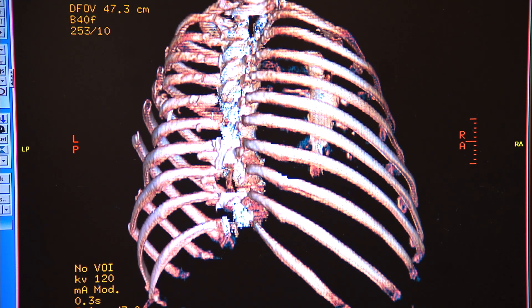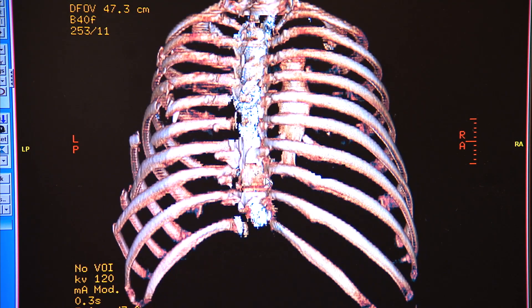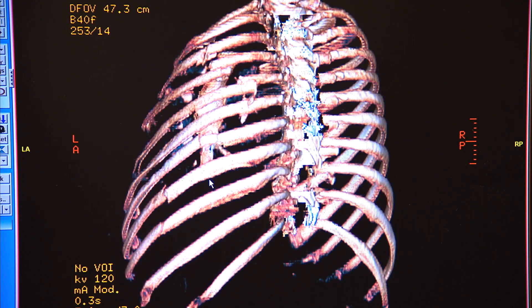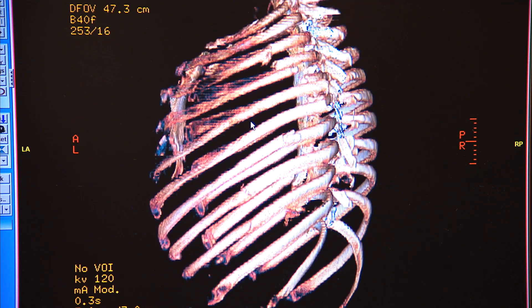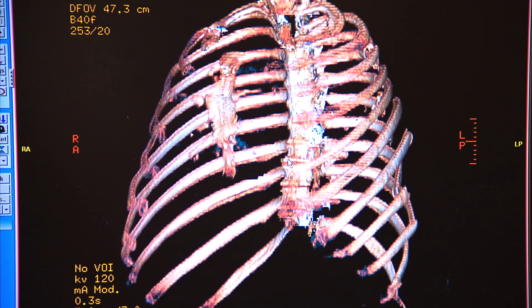We're looking at his spine along the backside, and as I rotate it around you can see the degree of displacement that's evident. Rotating it further, you can see that some of these ribs are multiply fractured and overriding. In someone who is awake and alert, these fractures would be excruciatingly painful.